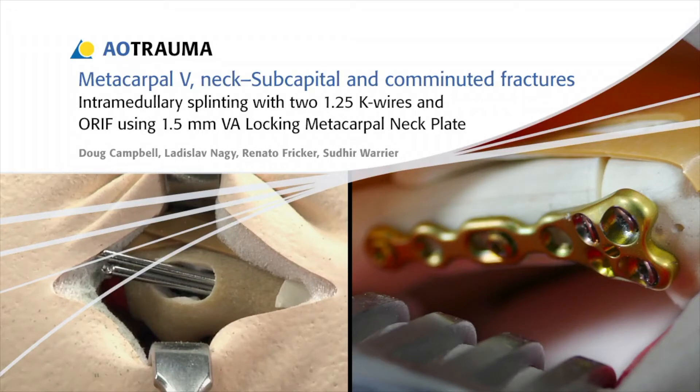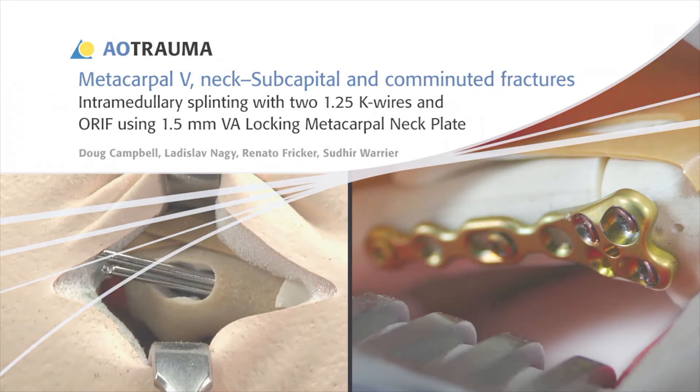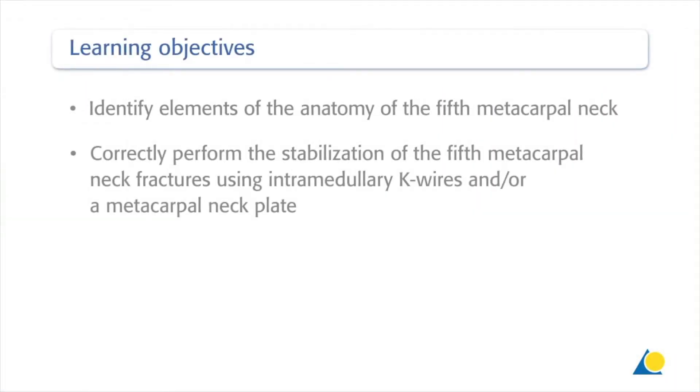In this presentation, two exercises will demonstrate differing treatment options for unstable subcapital and comminuted neck fractures of the 5th metacarpal. Upon completion of this exercise, you should be able to identify elements of the anatomy of the 5th metacarpal neck and correctly perform the stabilisation of the 5th metacarpal neck fractures using intramedullary K-wires and/or a metacarpal neck plate.